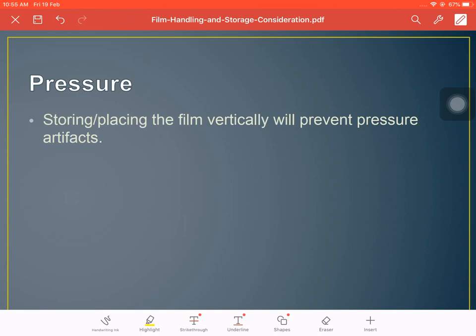So, our film, to have a maximum storage, ang film mapapahaba yung buhay. We can lengthen the lives of our films.